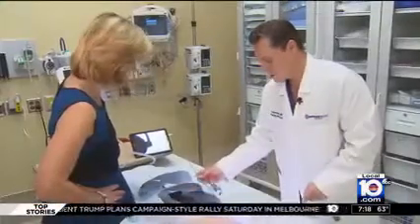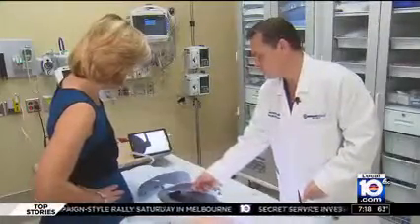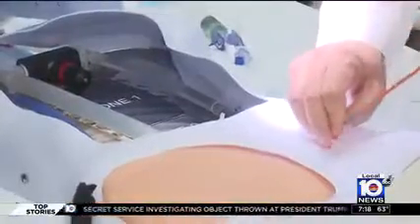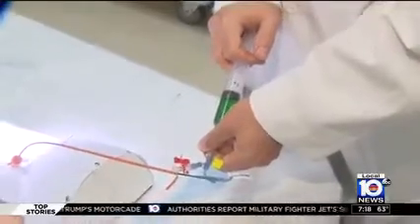With a balloon attached to the tip of the catheter, which will inflate and stop bleeding below the diaphragm, Dr. Igor Nichiparenko from Broward Health North showed how the REBOA procedure works. Using Fred the Mannequin, the doctor demonstrates how he quickly maneuvers the catheter into the aorta, inflates the balloon, and stops the bleeding.